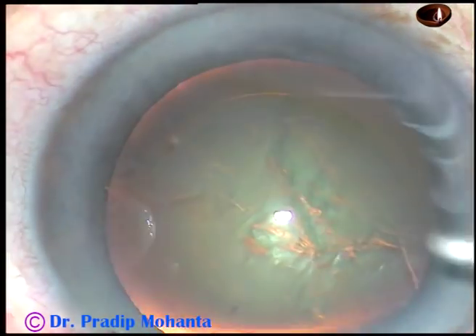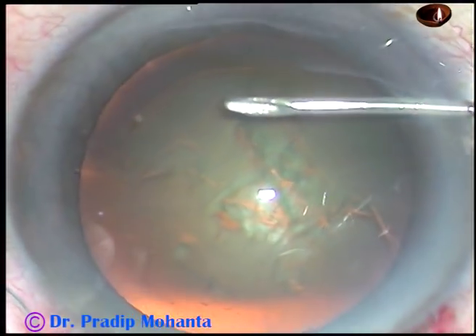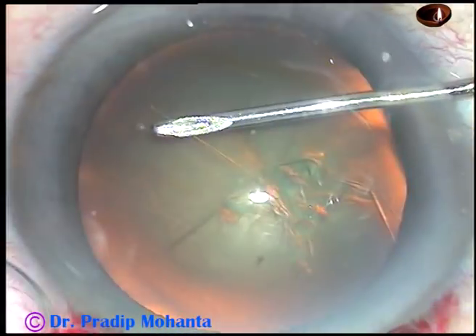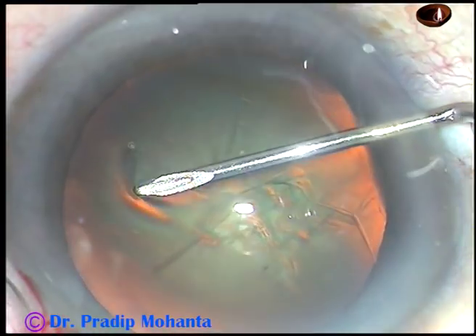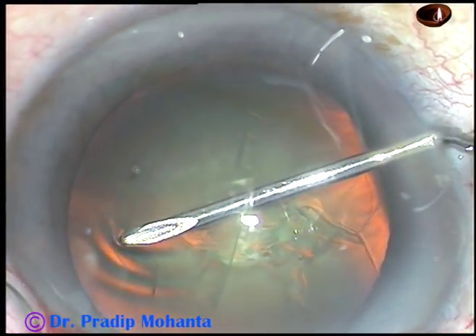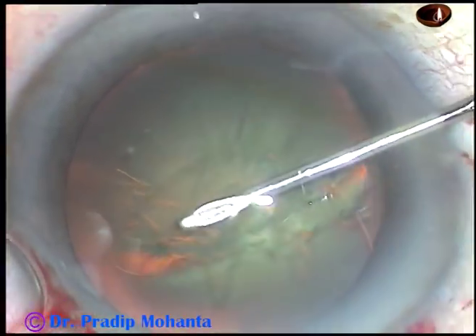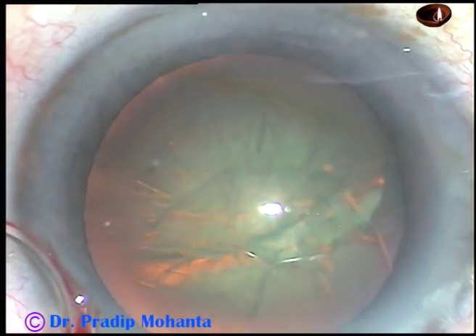And now, I introduce the needle and continue the rhexis with the needle. Since this paracentesis is very small, side port leakage of viscoelastic substance will be very minimal, and I can continue the rhexis very well. But I find that the capsule is not moving as in other normal cases, so I have to push a lot. And here, at around 2 o'clock, the rhexis has gone to the periphery to some extent.